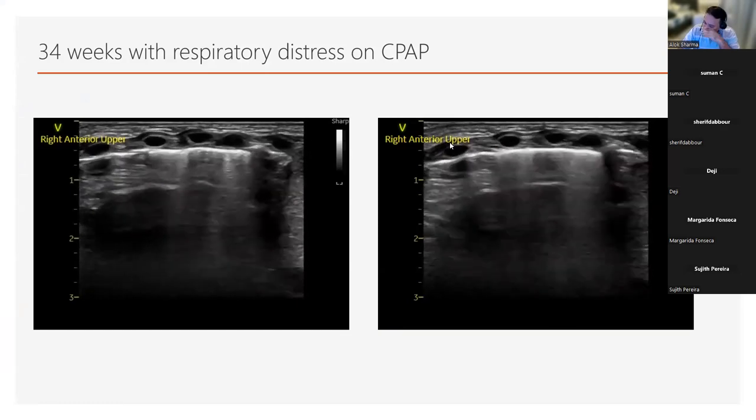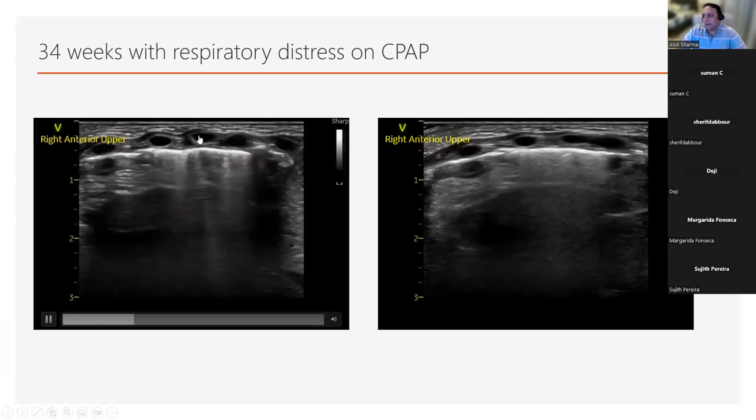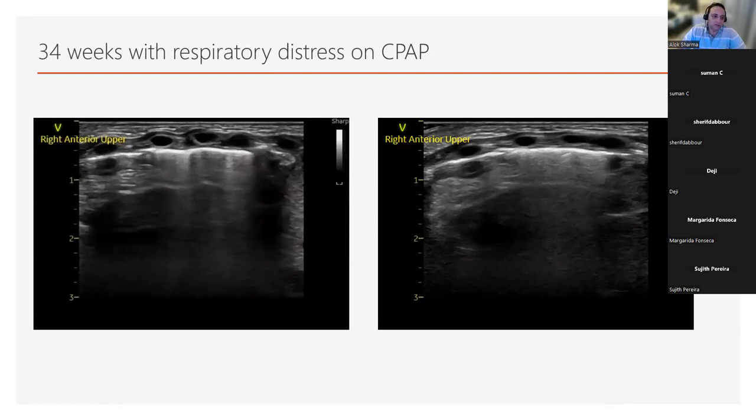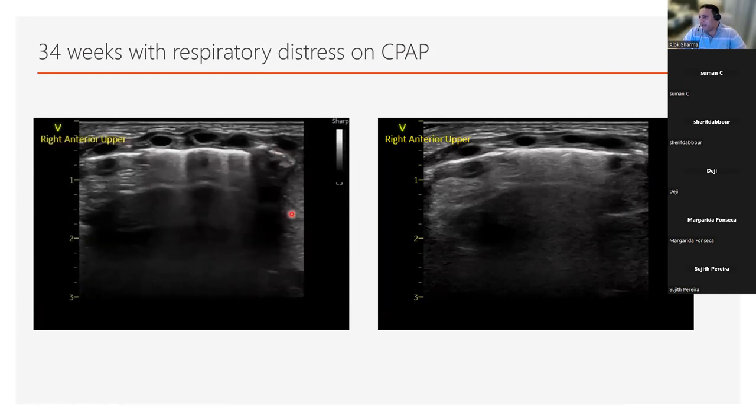And what about the pleura at the end? Just adjoining. Yeah, just because I'm not getting alignment, you're not seeing this region very well. I'm getting dropout. Can you see a rib shadow? Yeah. I wouldn't comment on a pneumothorax here because I'm just not well aligned. I need to demonstrate this better.